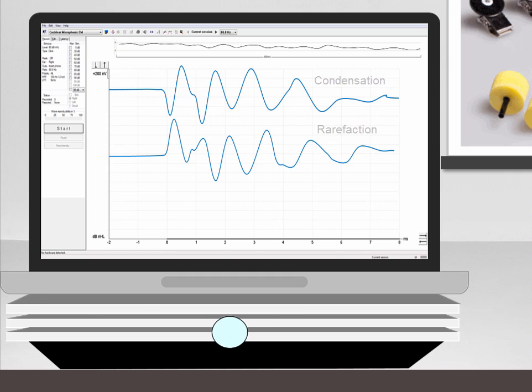If this can be seen, then it is essential to confirm that this is not a stimulus artifact. This can be achieved by performing a control run using the same parameters, but this time clamping the insert earphone tubing, stopping the sound from reaching the ear. If the measured potential remains, it is due to the stimulus artifact and is not a true cochlear microphonic. If the response disappears, then this indicates the response is truly present.